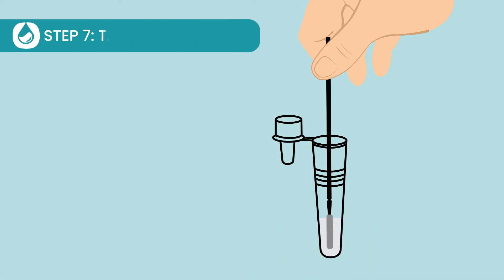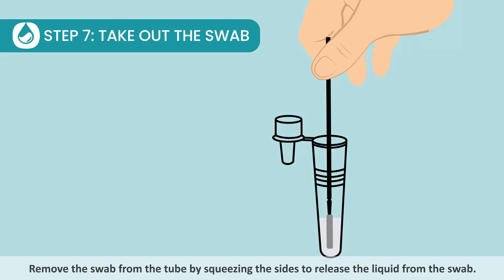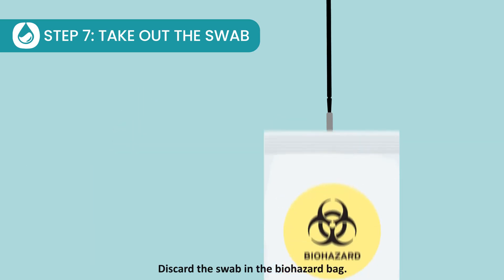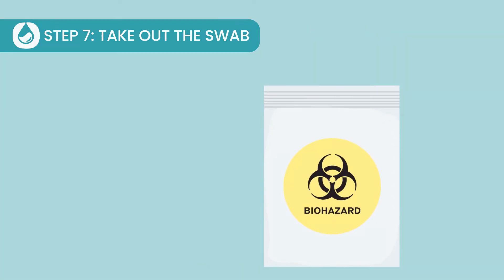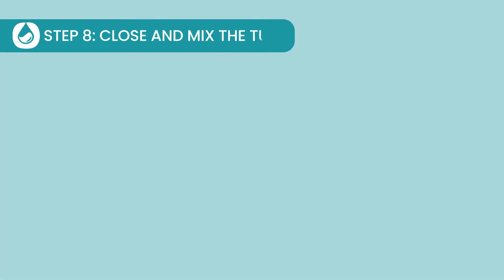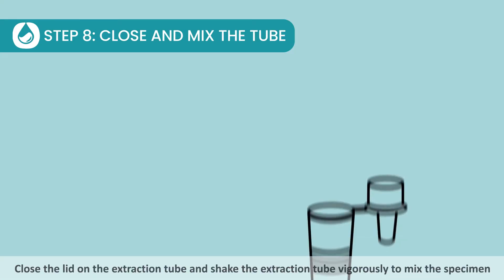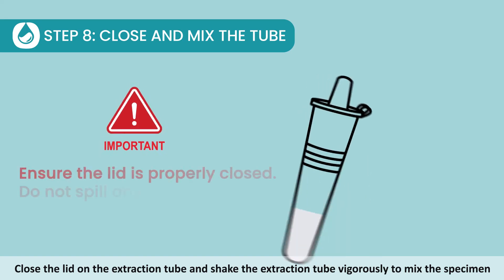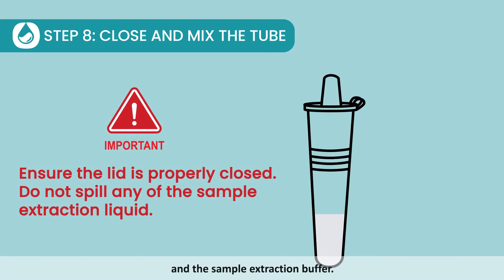Step 7: Take out the swab. Remove the swab from the tube by squeezing the sides to release the liquid from the swab. Discard the swab in the biohazard bag. Step 8: Close and mix the tube. Close the lid on the extraction tube and shake the extraction tube vigorously to mix the specimen and the sample extraction buffer.